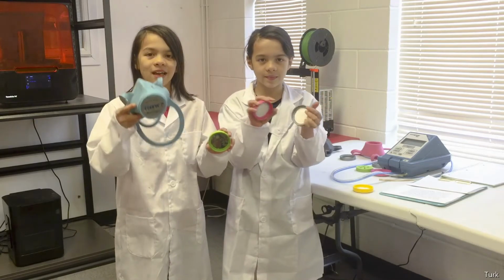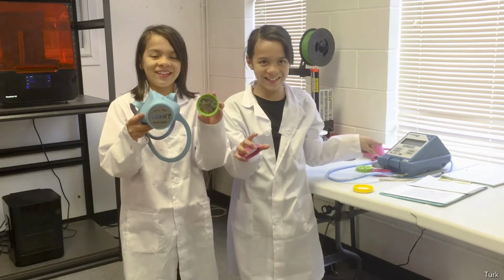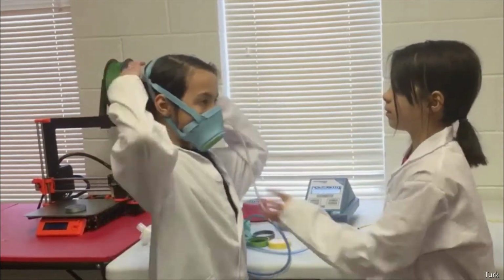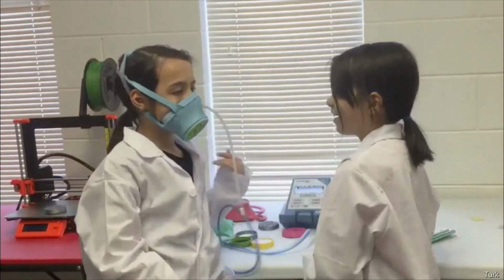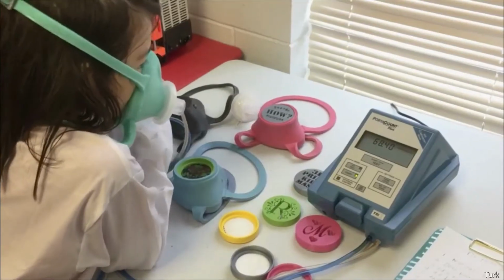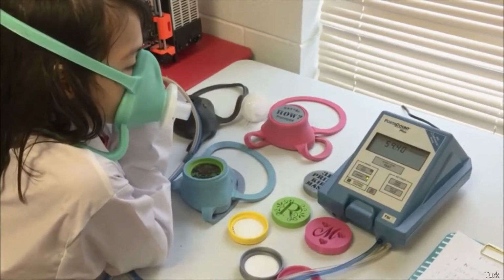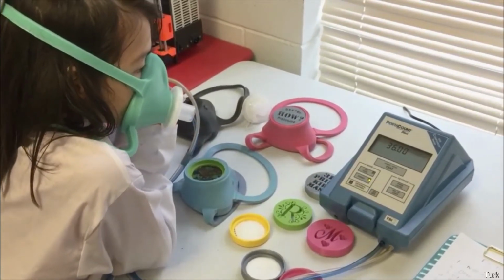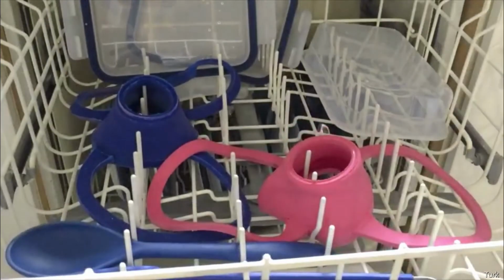Today we're testing our prototype mask and filter using our fit tester. To test our prototype mask and filter, we measured the particle of alcohol inside the mask and compared it to the particle outside of the mask. We collected a range of data from each filter, recording the high particle and the low particle counts.